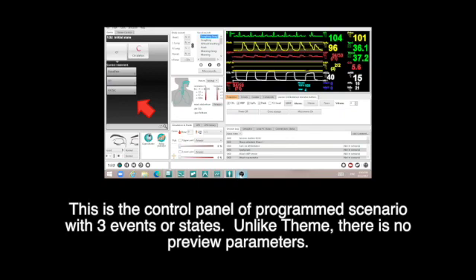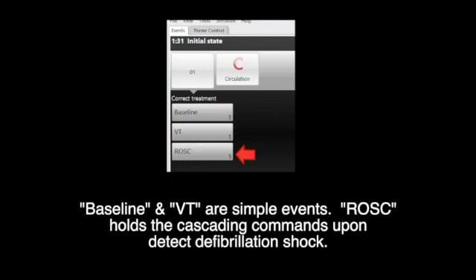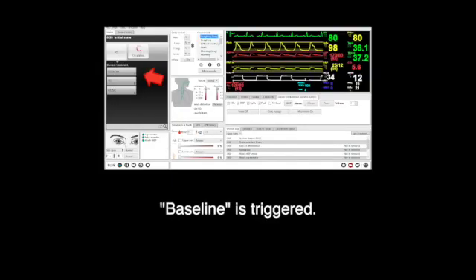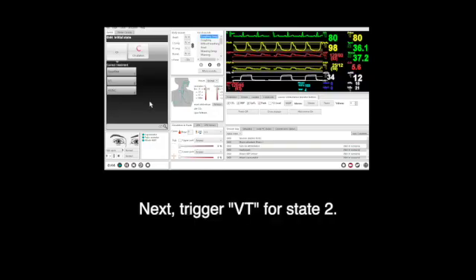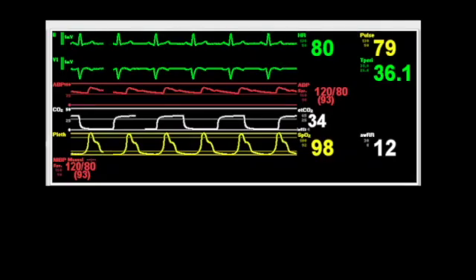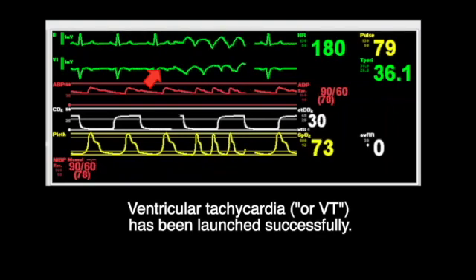Demonstrations of program scenario with LIBTS instructor applications. This is the control panel of program scenario with three events or states. Unlike themes, there is no parameter preview. Baseline and VT are simple events. ROSC holds the cascading commands upon detecting a defibrillation shock. Baseline is triggered — this is the baseline on the patient monitor. Next, trigger VT for state 2. Ventricular tachycardia has been launched successfully.